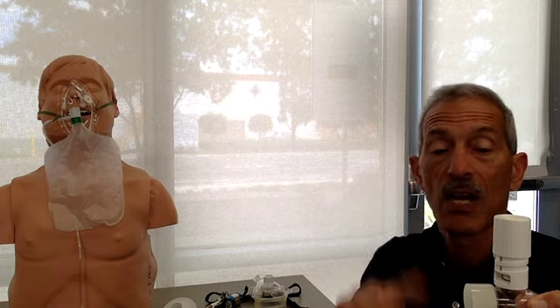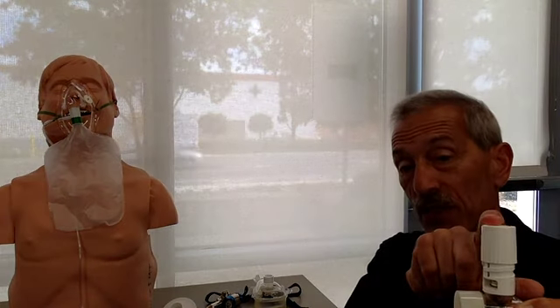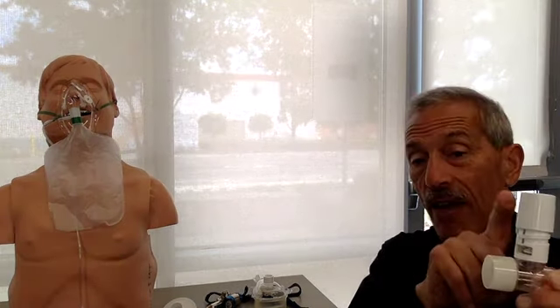The county says 10 is the max for us. It always comes set at 5 initially. We always try to start at 5. We're especially concerned about people who have COPD, emphysema especially, because high pressure can actually rupture their lungs. So we keep it at 5 and see how they do. If they don't improve, then the medic can turn this to the next higher pressure.